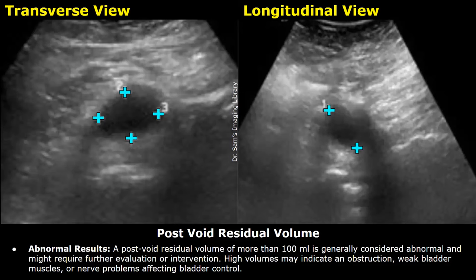High PVR volumes can be due to obstruction, weak bladder muscles, or nerve problems affecting bladder control. Male patients with benign prostatic hyperplasia may have an abnormal post-void residual volume. The enlarged prostate can cause obstruction in the urethra, which affects bladder emptying and leads to an increased post-void residual volume.